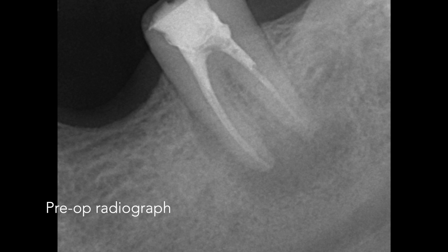Here we have the pre-operative radiograph of the mandibular left second molar. The tooth has been obturated using bioceramic sealer and gutta-percha points.